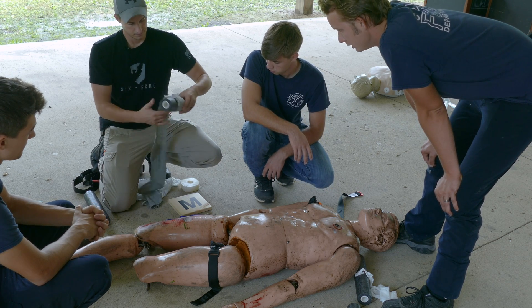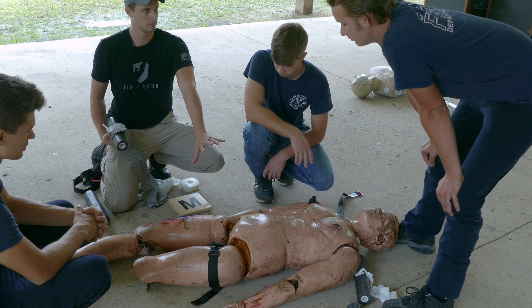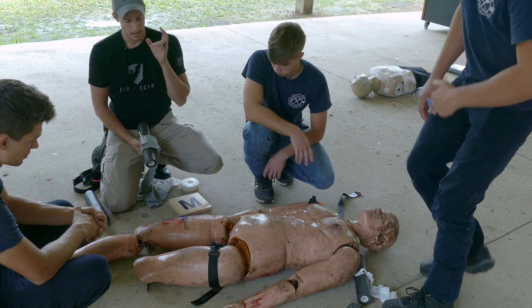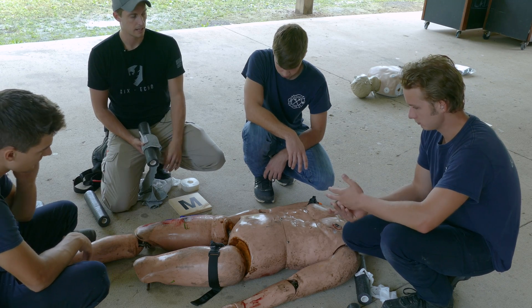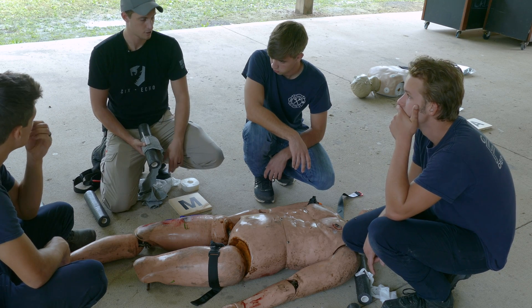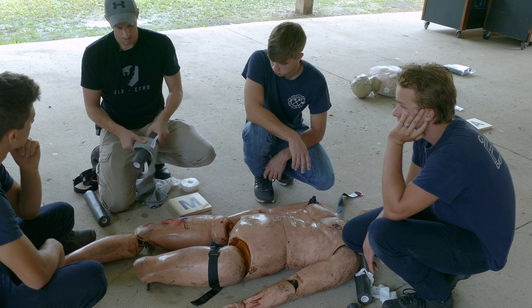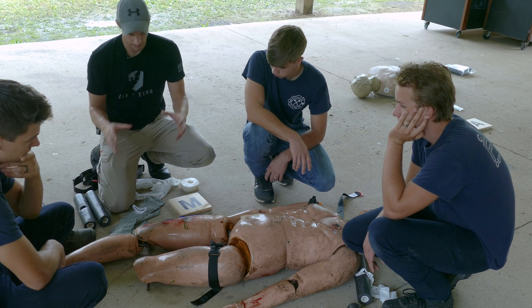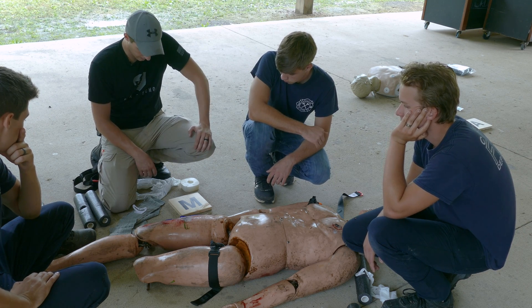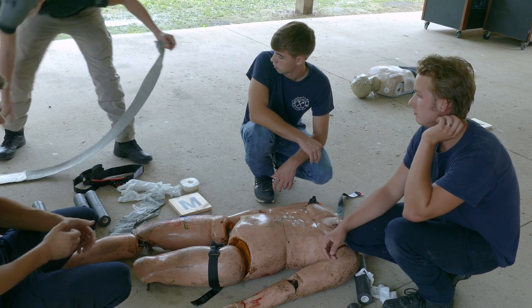Right now we're just talking junctional — later when we get to circulation we'll talk about converting tourniquets and wound packing. But if it's an extremity with severe bleeding, we're putting a tourniquet on first. If it's not severe enough to need a tourniquet in this phase, we're not doing wound packing. Right now: tourniquets on extremities, wound packing for junctional areas — which includes the neck — and we'll talk about tourniquet conversions in a minute.